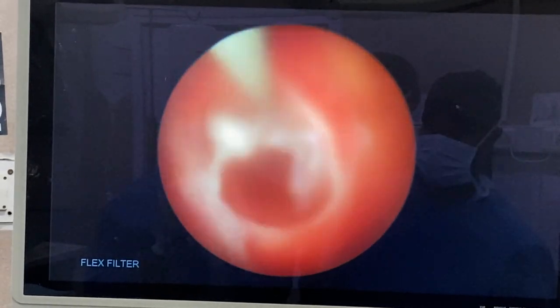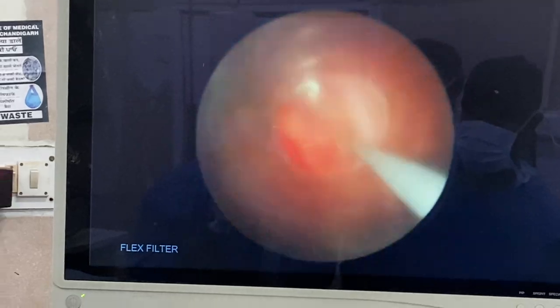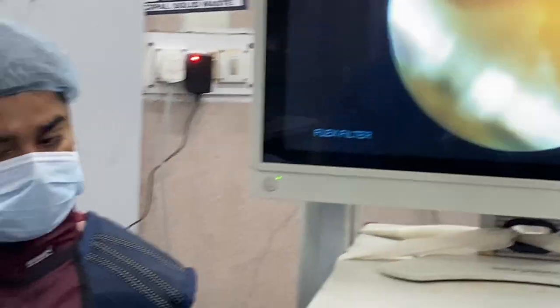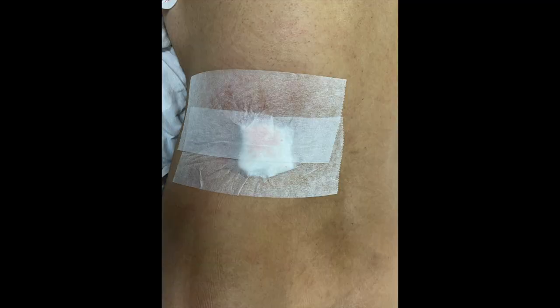The track looks fine without any significant bleeding. This is the final X-ray picture showing complete stone clearance. Tubeless PCNL with dressing was done.